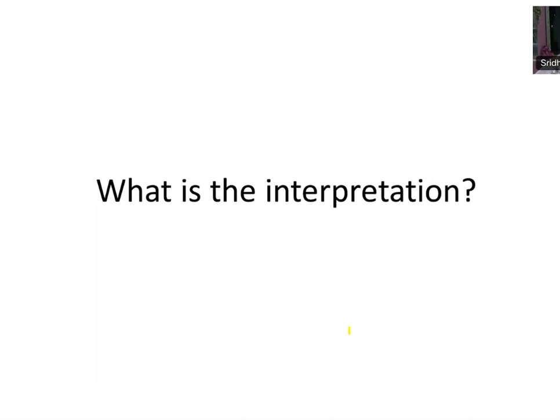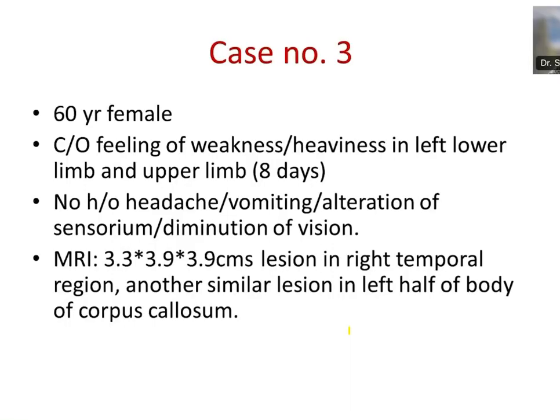So you saw two different cases. In one case, you picked up a typical IDH mutant by IHC. In the second case, you had a phenotype of ATRX loss and TP53 mutant. In those kinds of cases, you should always advise sequencing before you call it IDH wild type. The third case first, anybody, Abhirami?